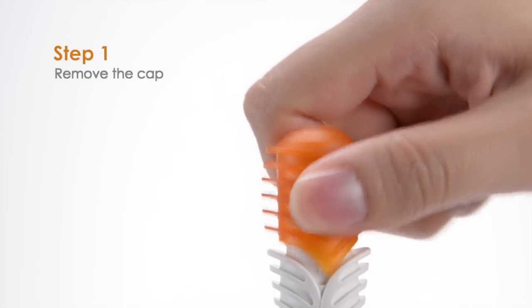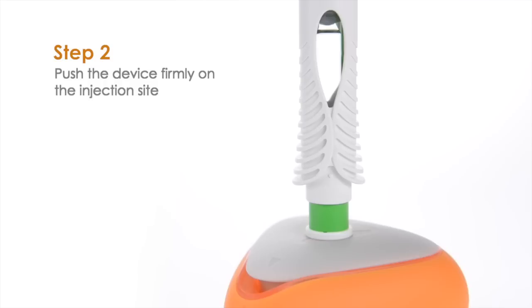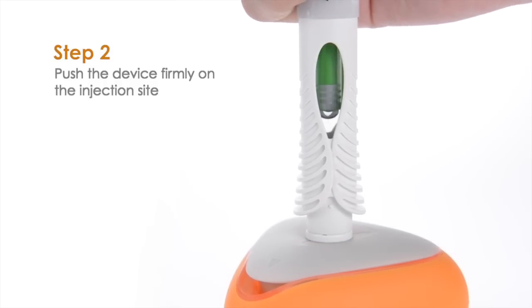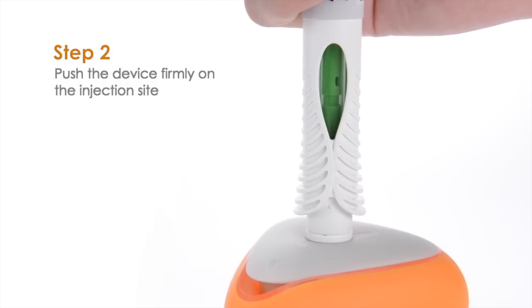Step 1: Remove the cap. Step 2: Perform the injection by pushing the device firmly on the injection site. There will be two audible clicks — the first signals the start of injection and the second signals the end.